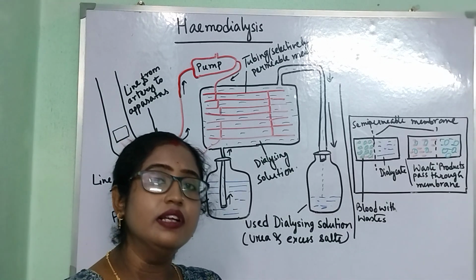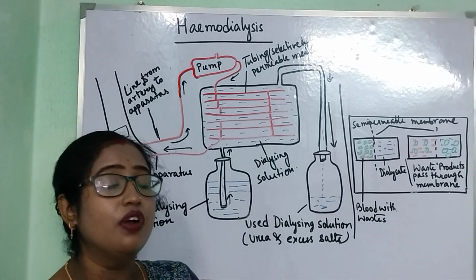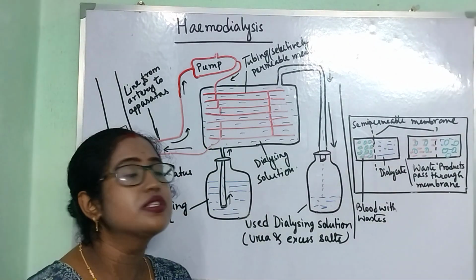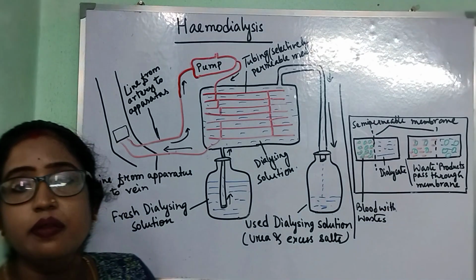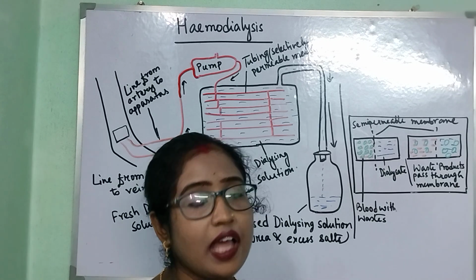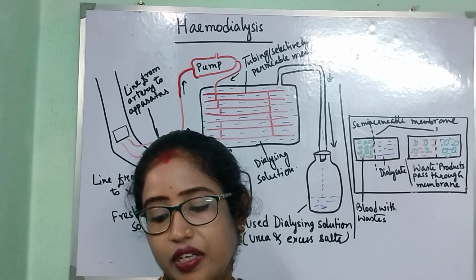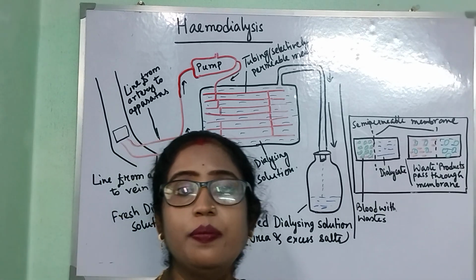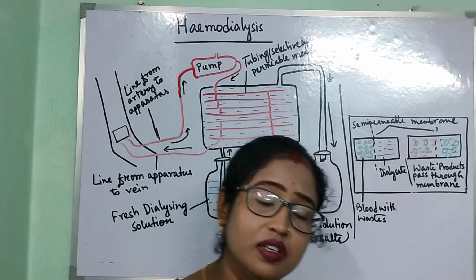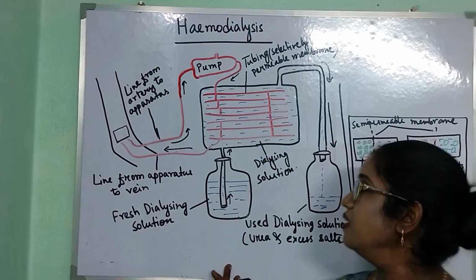If the toxic material is not released properly from our body from time to time, it accumulates and may even lead to death. So in that case, we need this kind of apparatus. In patients who have heavy blood sugar content, both kidneys may get infected or may not be well enough to perform their basic function. In such a patient's case, an artificial kidney is used for dialysis.